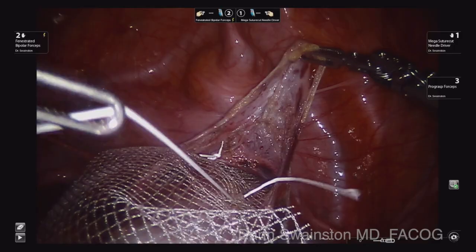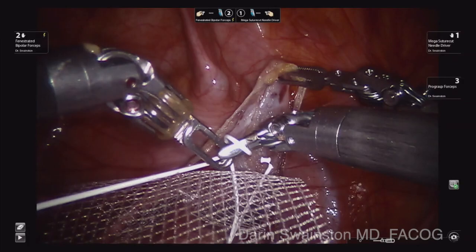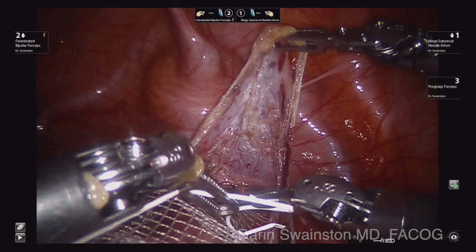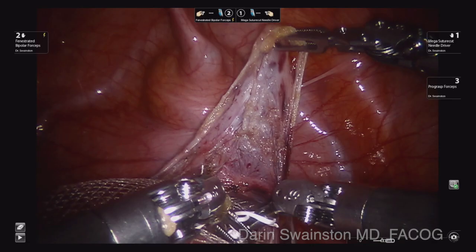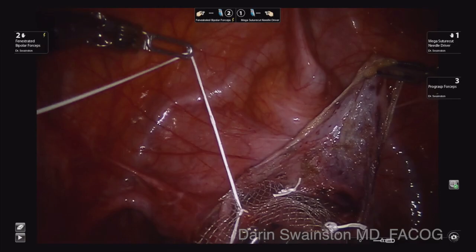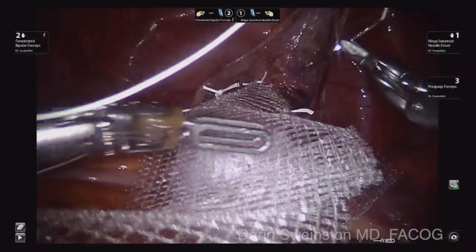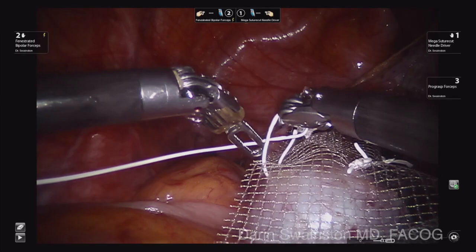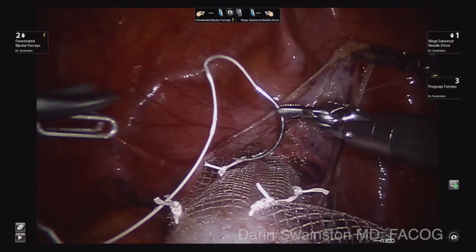How many sutures to place — that is the six million dollar question. We do not want to put too many and we do not want to do too little. Anterior I went a little less than normal, and posterior I probably put a little more. Some people actually run a V-lock after doing a few tacks to make sure the mesh is married to the vaginal mucosa. I do not think that is necessary, and then you have that V-lock suture pulling on all the vaginal mucosa, which I do not love. I have sped this up to eight times speed so that once you see how I figure out where to place it, it is just all about tacking these in.